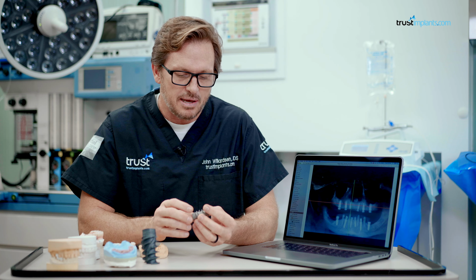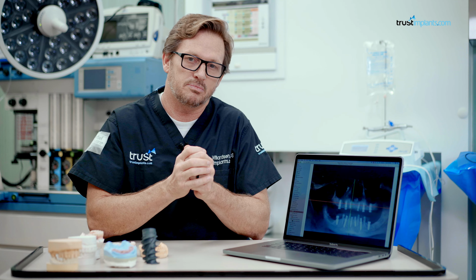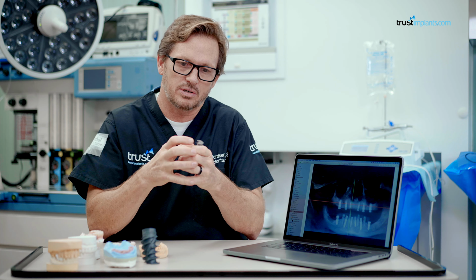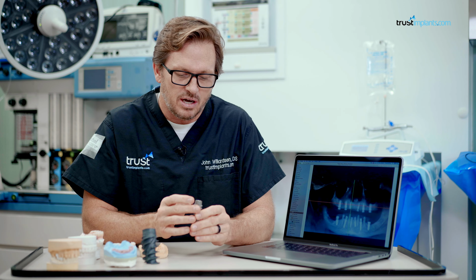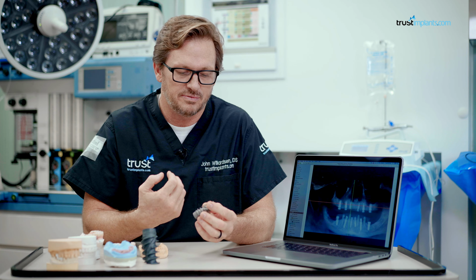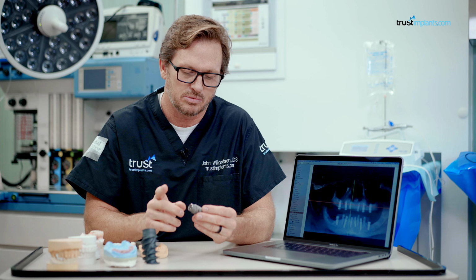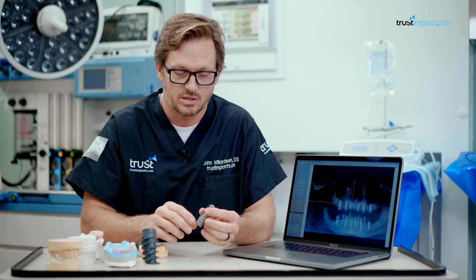And so by minimizing the removal of the bone, I can actually, it's called osteocompression, where we're expanding the bone, and that way I can drive this implant and the bone kind of is elastic and it'll kind of go back around the implant. So the Straumann BLX implant is a wonderful implant. It's a very high quality, commercially pure, grade 4 titanium. It's not an alloy, it's a commercially pure titanium. And then the design and how it drives into the bone, it's a really awesome implant.